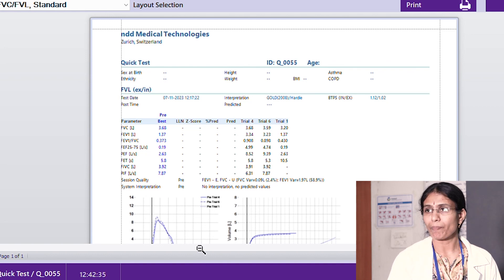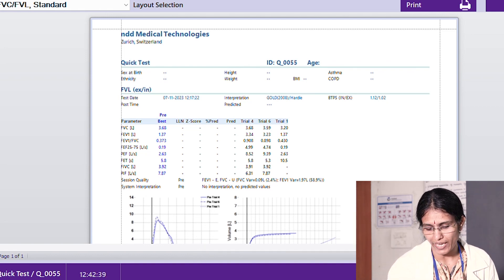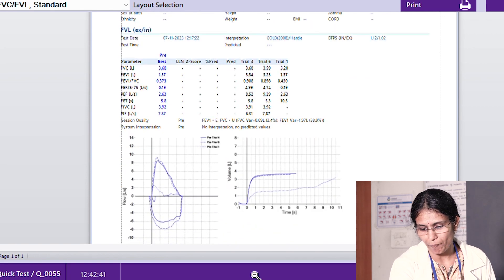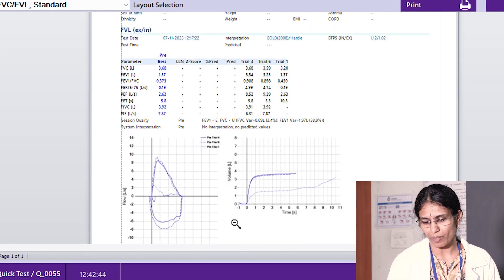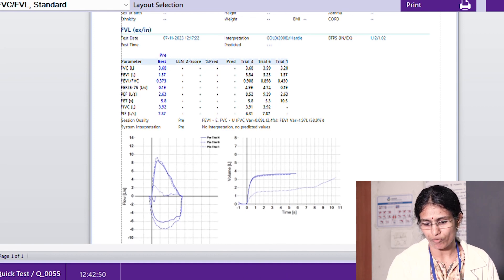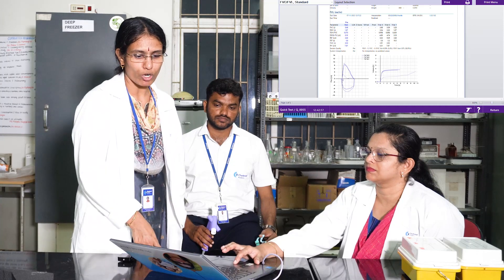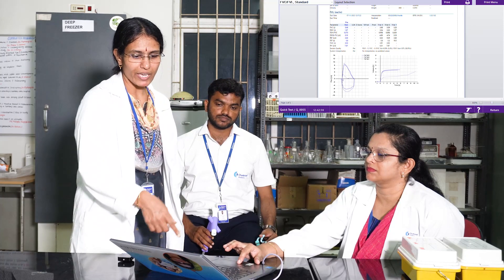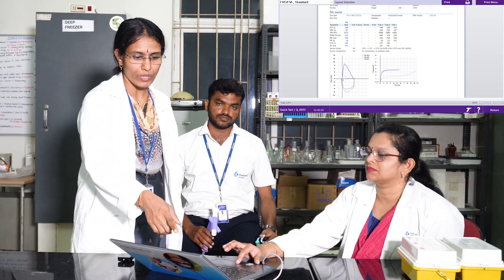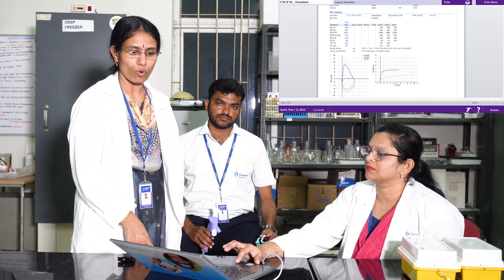You can also see the peak expiratory flow in the graph. That is the highest flow obtained during the manoeuvre — the peak expiratory flow — and it occurs during the first 20% of the FVC when expired. The peak flow occurs in normal individuals. Similarly, the peak inspiratory flow can also be obtained, occurring midway between inspiration and expiration. What you see here is the normal flow volume loop.